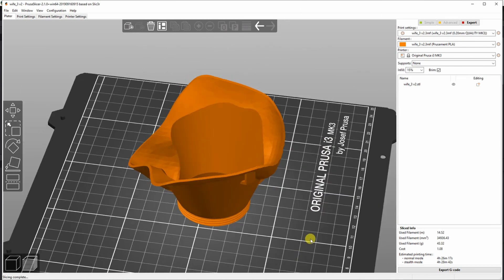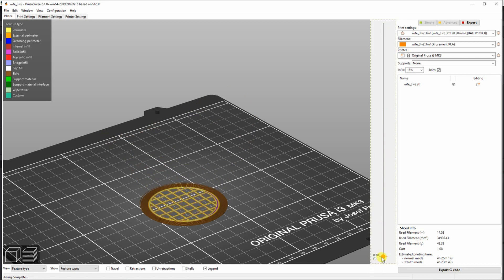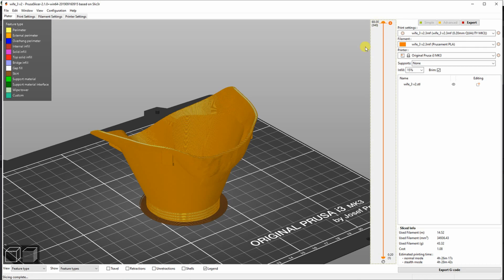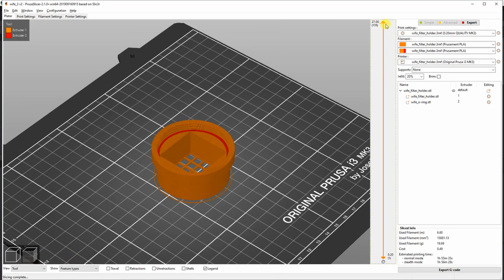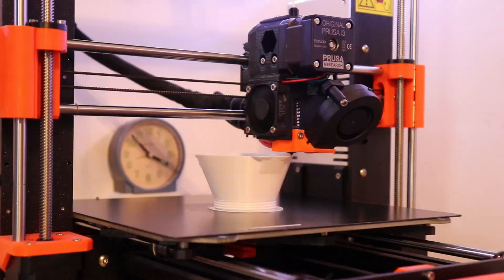Let's preview the printing in the slicer. I'm using PrusaSlicer and printed the mask in PLA with 0.2mm layer height — later I'll coat it with epoxy resin for better cleaning. This is the filter holder. I use the multi-color 3D printing technique where I replace the filament manually to print two layers with Obitech Soft PLA for better sealing. The printing process took me a little more than three hours for the mask.